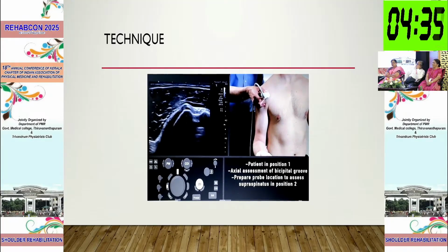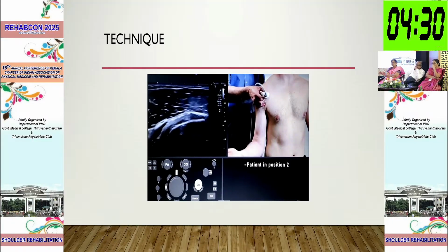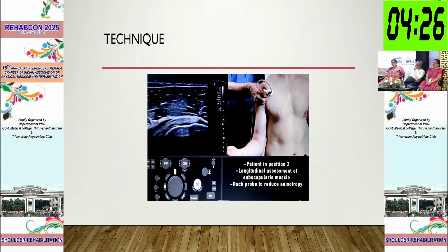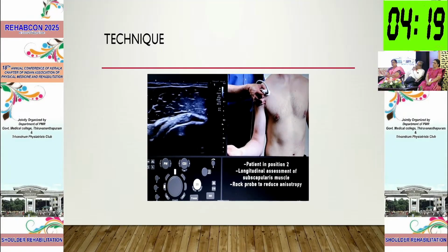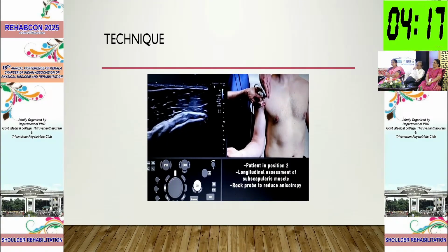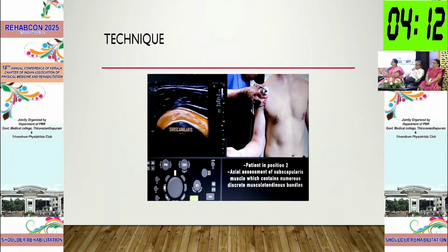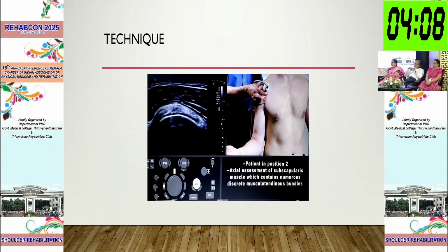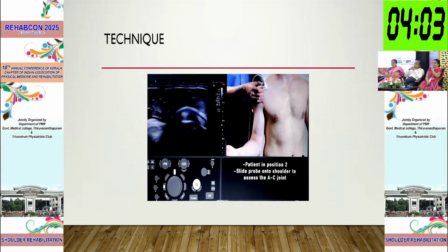Now, this is the simple ultrasound technique. You may finish within 10 minutes. But the most important thing is that if you can get a good window, everything is easy. But you have to get a good window, and it takes a little bit of skill to identify the structures properly. Now, almost all tendons can be easily identified here. The muscles can be identified here. And the only things left will be the cartilaginous structures and ligaments. Sometimes by the side, you can identify ligament injuries also.